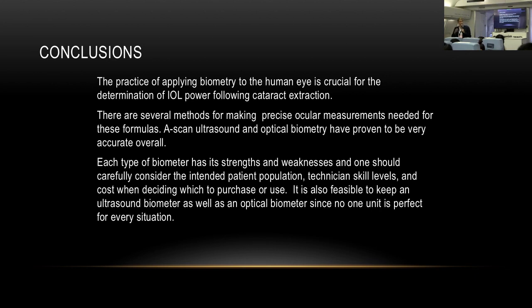You want to think about the skill level of your technicians and nurses, the people that are doing these tests, because A-scan ultrasound, while inexpensive and portable, requires quite a bit of skill and practice, so there's that trade-off. But if you decide you want an optical interferometer, a Lenstar or an IOLMaster, you have to keep in mind, again, your patient population.